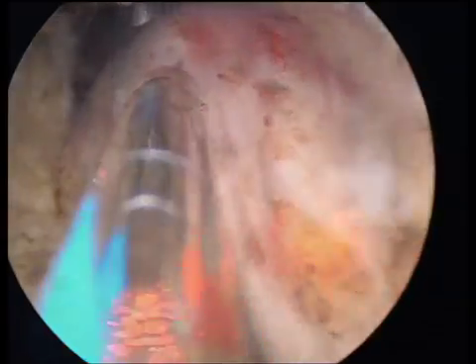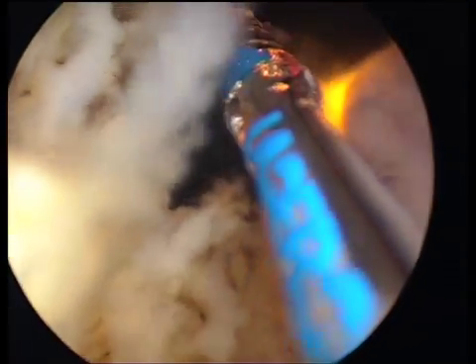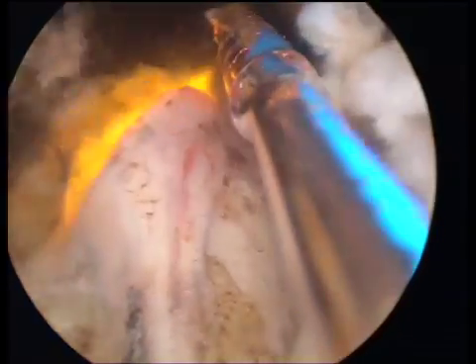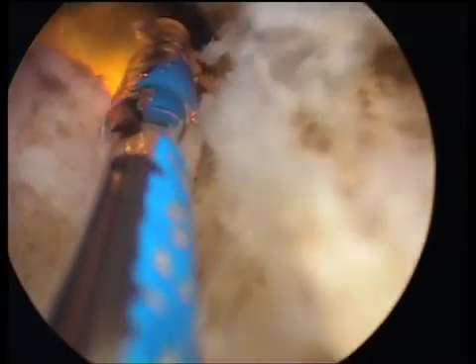I have found this to be the safest way of dealing with the median lobe. This prostate had a very large median lobe. You can see how easily it is vaporized, and it is very important that the beam is always pointing medially to avoid the risk of damaging the ureteral orifices with the laser.